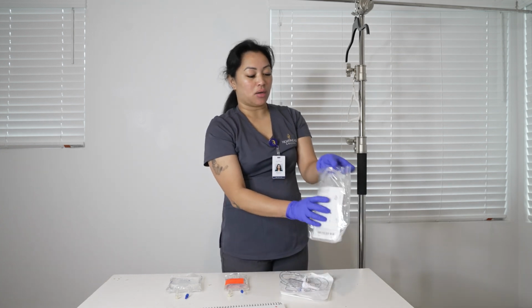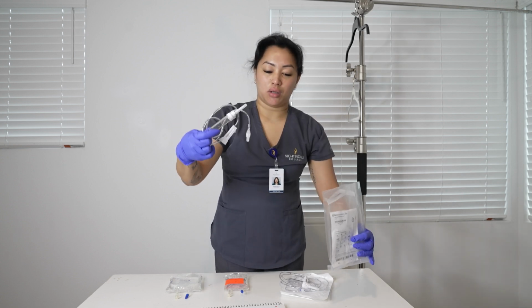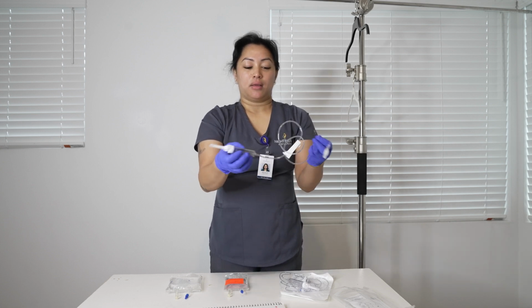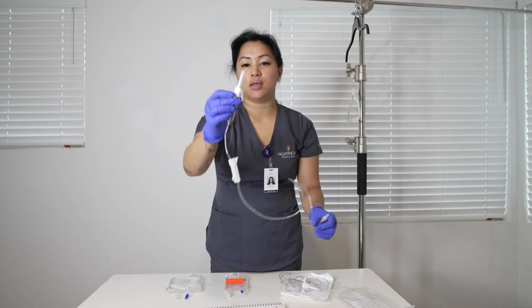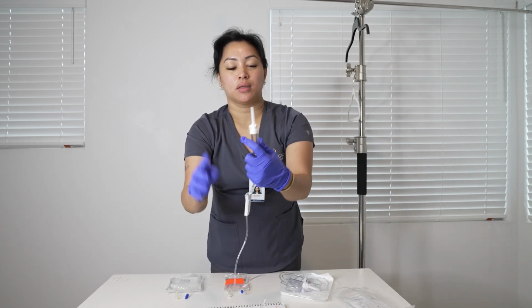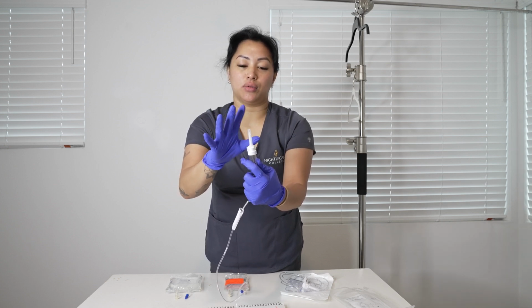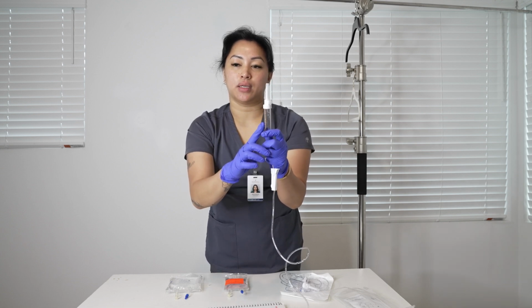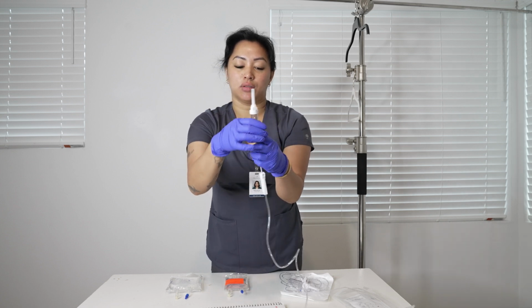And then it's almost the same thing for the secondary. I did it second, but the only difference between the primary and the secondary, same thing. The spike is sterile with the cap on, and the drip chamber to regulate. You can ensure how many drops are going through the tubing.